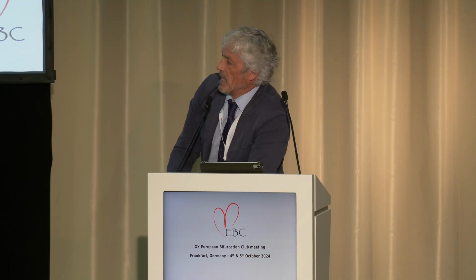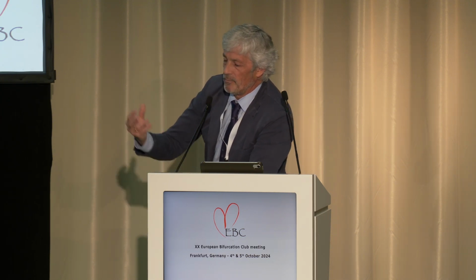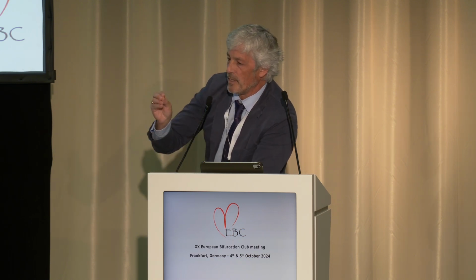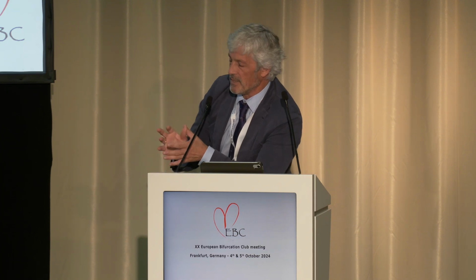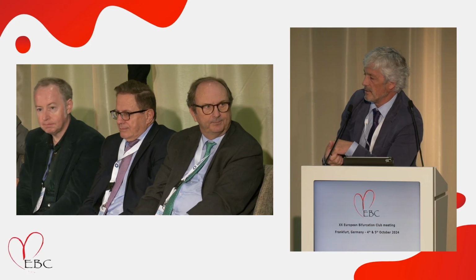But I think that both can be used. For the planning initially, maybe I prefer IVUS because I see the whole plaque burden, the whole vessel size. But for example, when the stent is implanted, OCT is better in order to show where the struts are and what's the malposition or whatever. Every technique has different shortcomings and different advantages, but I think you can use both in these osteal lesions.